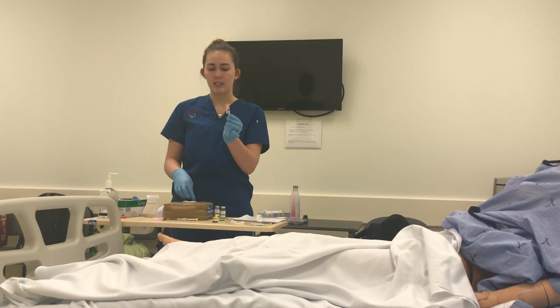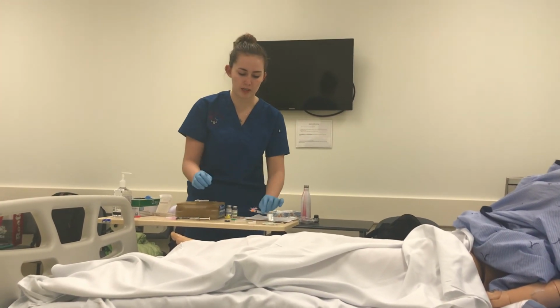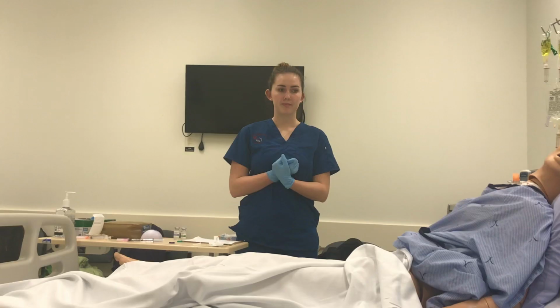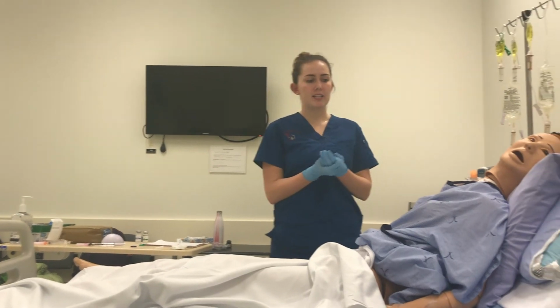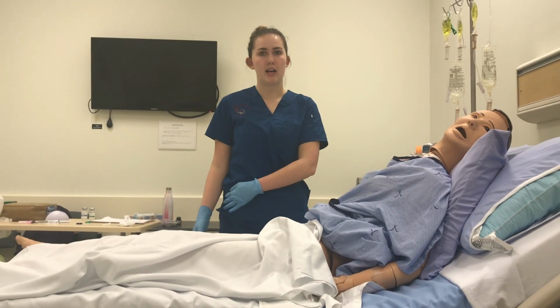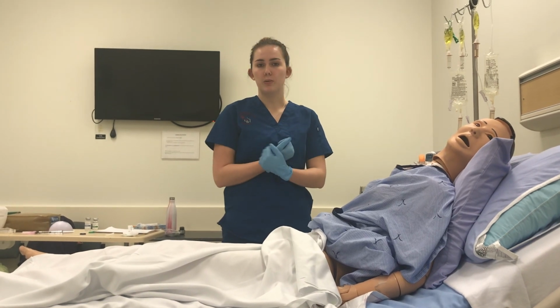And in a normal case, you would recap this needle by putting on the safety. However, we're going to just recap this needle. We're now going to administer the IM injection. Injection sites include the deltoid, the vastus lateralis, and the ventrogluteal. For the purpose of this assessment, we're going to do the deltoid.